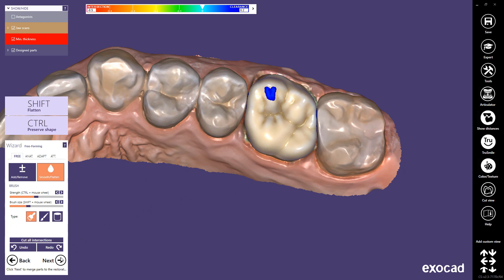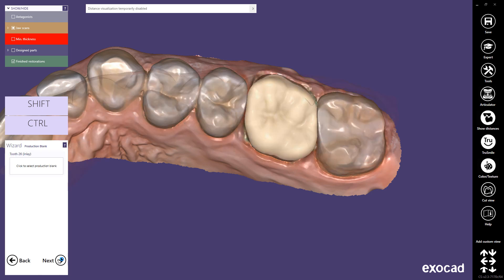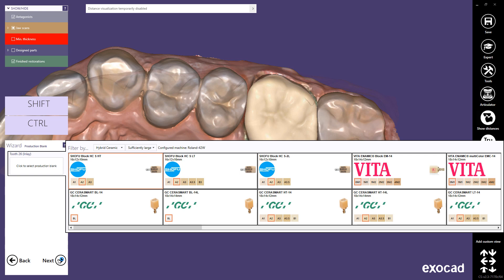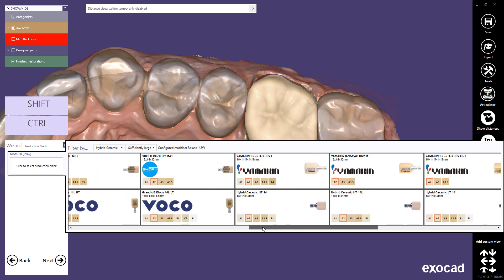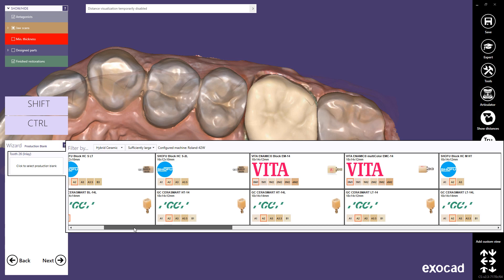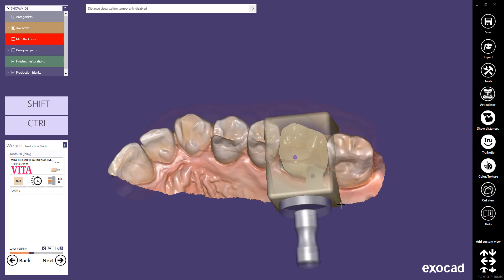When you finish the free-forming, proceed to the next step. In the next wizard step, you can start the INCAD nesting. Exocad INCAD nesting helps you to interactively place single or multi-unit restorations into milling blanks during your design process. Select a production blank and the shade. Ensure that the material and production blank you choose for manufacturing your designed restoration is suitable for the purpose of the reconstruction. Indications for use of the material are defined by the manufacturer.